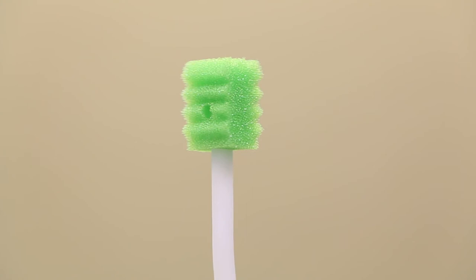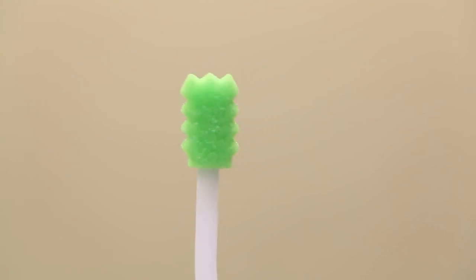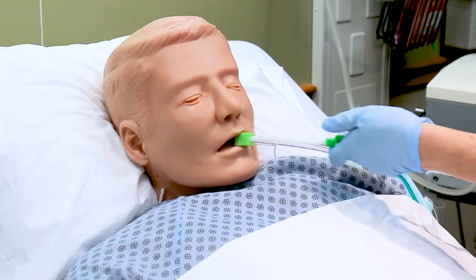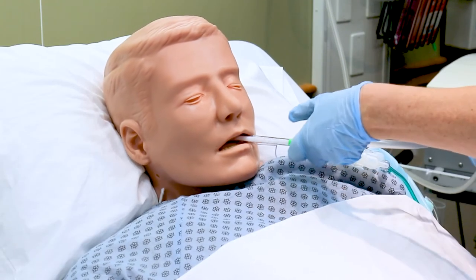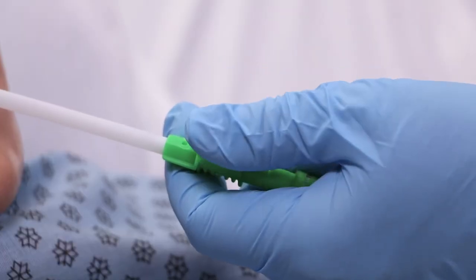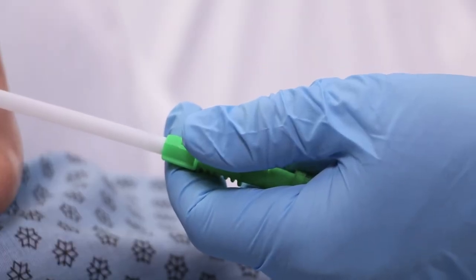The perpendicular ridges on the suction swab help clean between teeth and stimulate the oral cavity. Clean the teeth and swab the oral cavity with the suction swab for approximately one minute. To create suction, place your thumb over the thumb port.